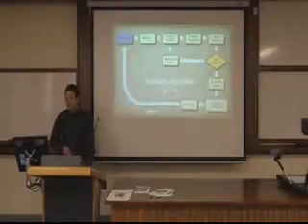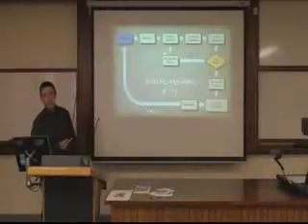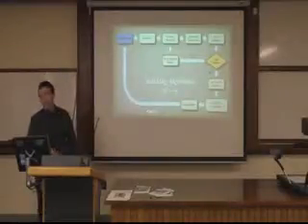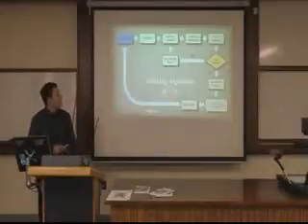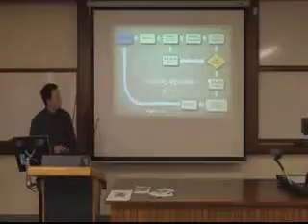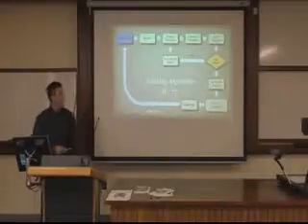And so you can see here, I import the images, I set my regions of interest, I create a dynamic thresholding. So thresholding is basically where you've got your image and anything above the threshold turns into white, anything below the threshold value turns into a black pixel value. It's called binarization. And then I perform connected components, I detect the endpoints, I check if they're valid endpoints, if not, I repeat a process that only iterates through once, that's all that's necessary. And when I find true features, I project these into 3D coordinates, and then I use a Kalman filter. And this process is applied to an orthogonal image pair.